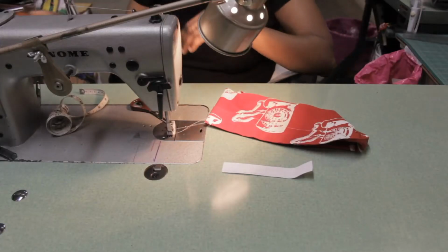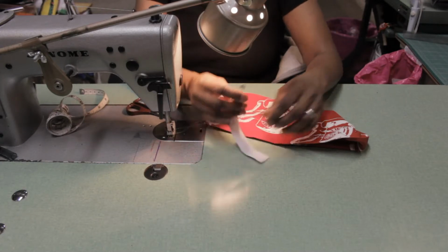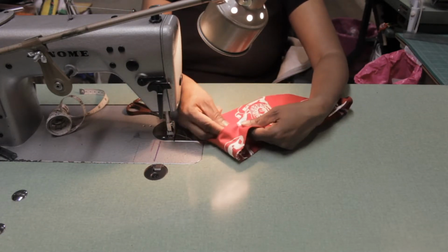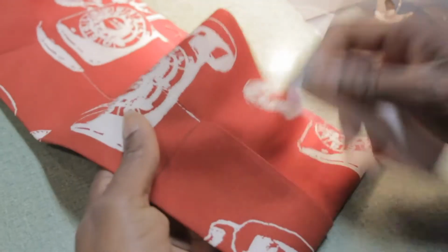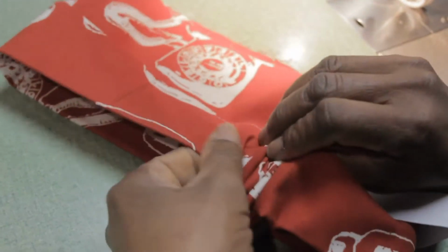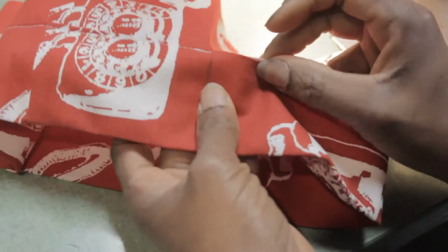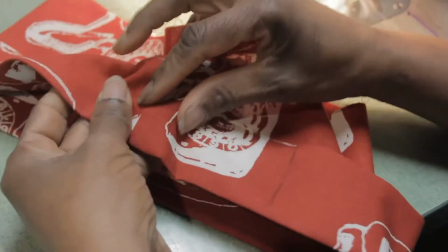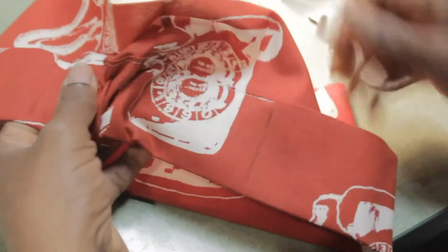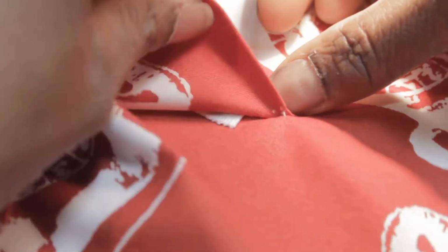So we've got our 5.5 inch piece of elastic. We're going to take a safety pin, put it on the elastic, and we're going to run that elastic through this little channel that we've just made. Now you're going to run it through, and you're going to be careful that the end of the elastic here doesn't go past the first line that we've made, because we need to tack that elastic on that line. So I'm going to feel so that the elastic, right now my line is here and my elastic goes to about here.